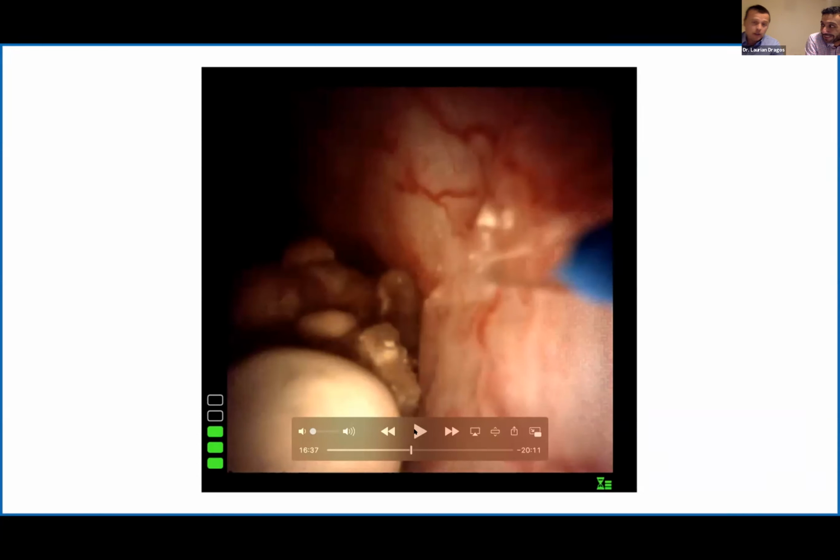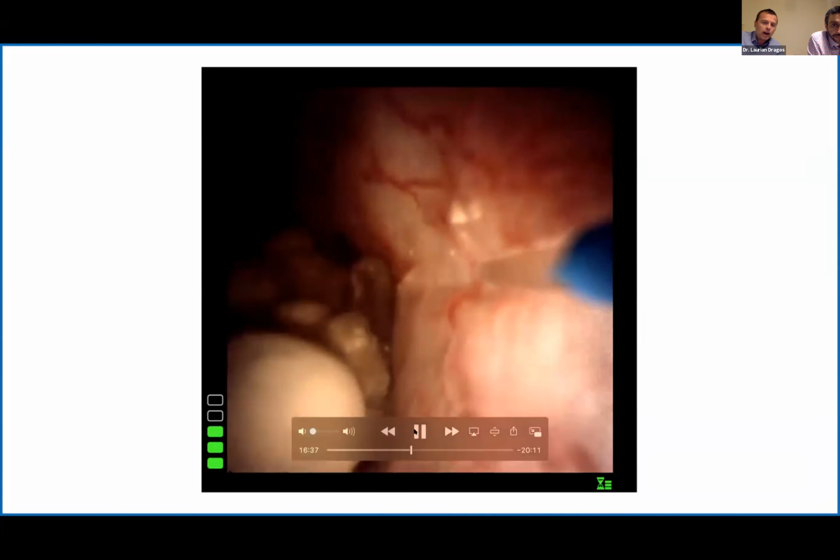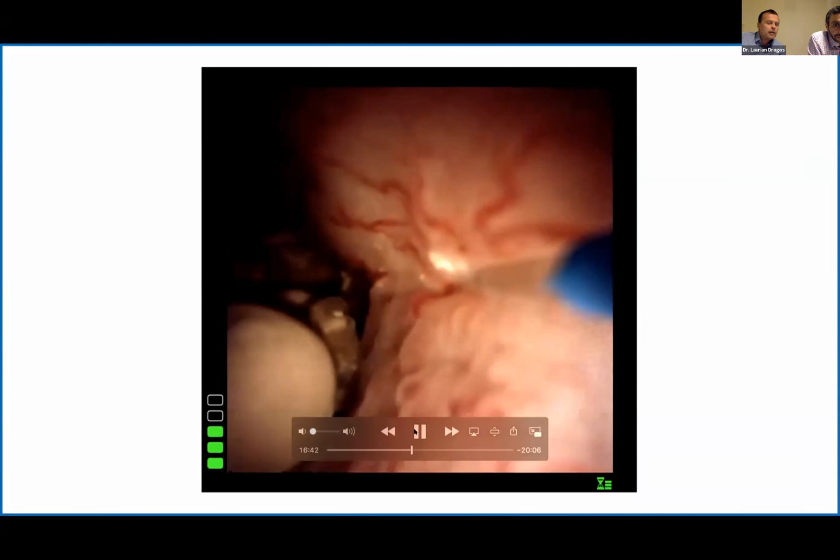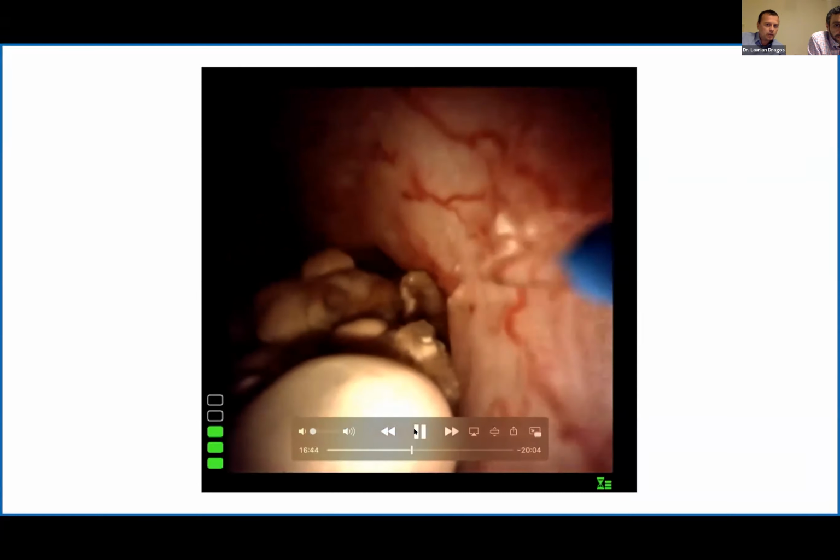Yeah. So look, we are trying to be here as honest as possible. And this is really how the surgery went. It's edited in terms of cutting off some parts because it would have taken too long. But for example, here, I've inserted the fiber, and there are those moments when you put the fiber tip in, and then you look at the valve and you try to fix it. And look, my movement was quite impaired. I don't remember if I told you why, but you'll see at some point.